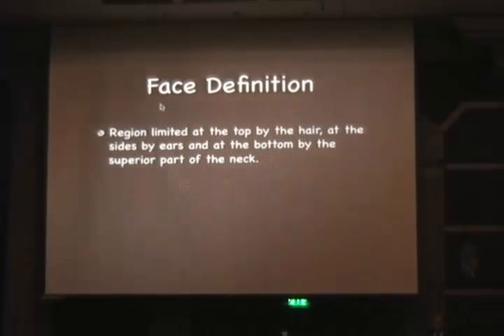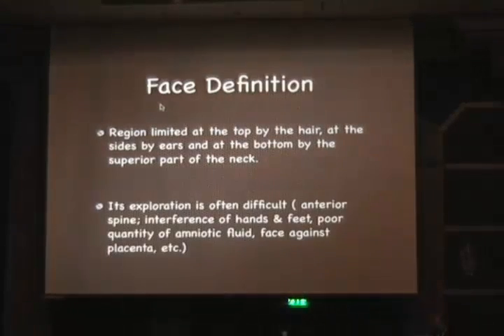The definition of the face? The face definition is the region between the hair, on the side the two ears, and on the bottom by the superior part of the neck. Usually it's very difficult to explore the face, especially in the second trimester.